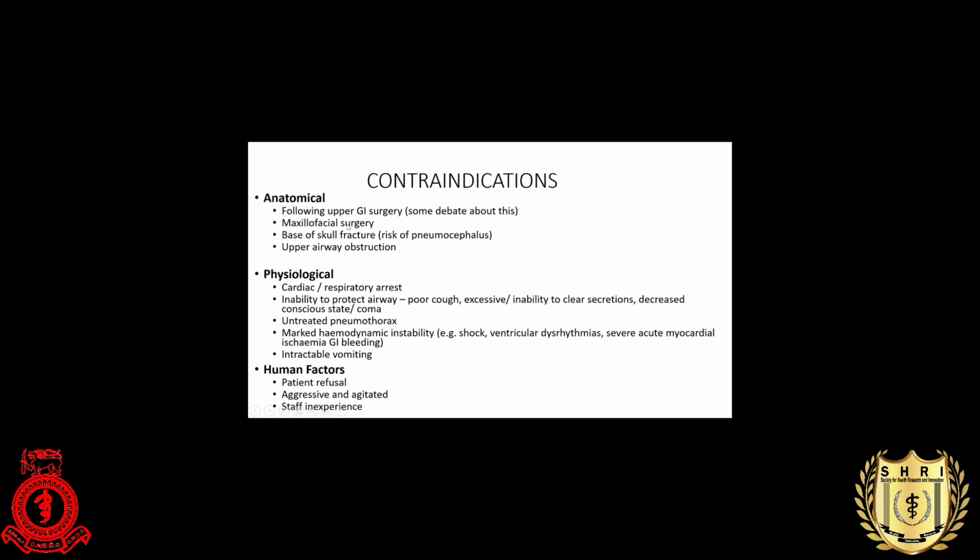Physiologically, we do not use it if the patient has active cardiac or respiratory arrest, or if the patient is not able to protect his airway, that is poor cough and decreased level of consciousness. Also for patients with untreated pneumothorax, we are not going to use this mode. And intractable vomiting.